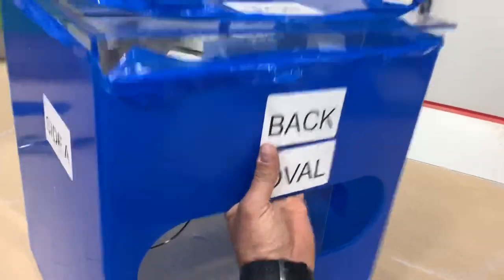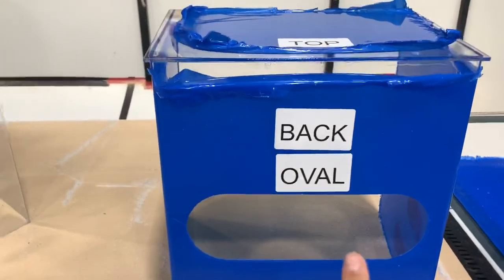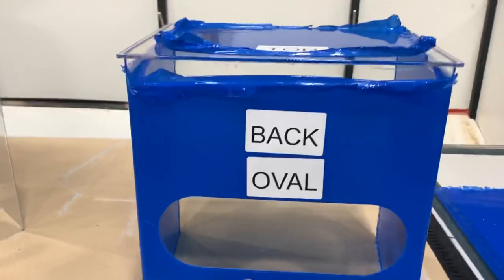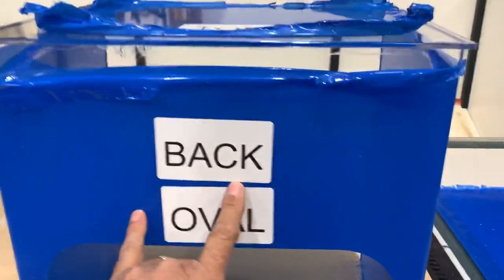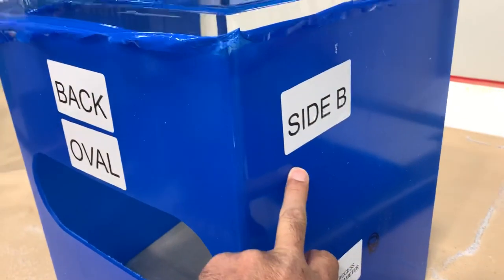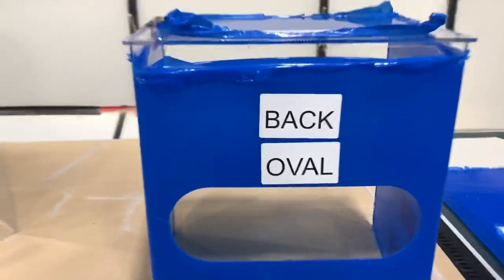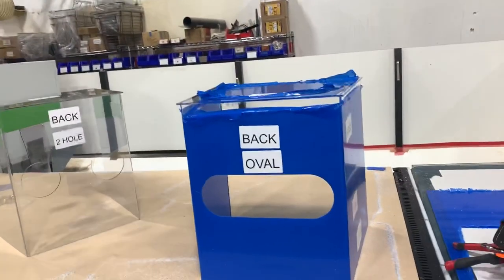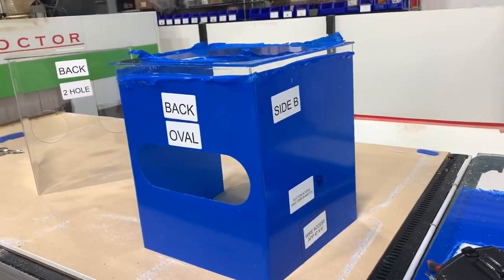If you're a doctor or medical person and you want to make any changes, the top is the top piece, the back is where the medical technician would stand doing the work, Side B is on the right-hand side, and Side A is on the left. So if you want to discuss changes, you can look at this video and tell me, for example, 'On Side B, I want to add a suction access hole that's 20 millimeters in diameter.'